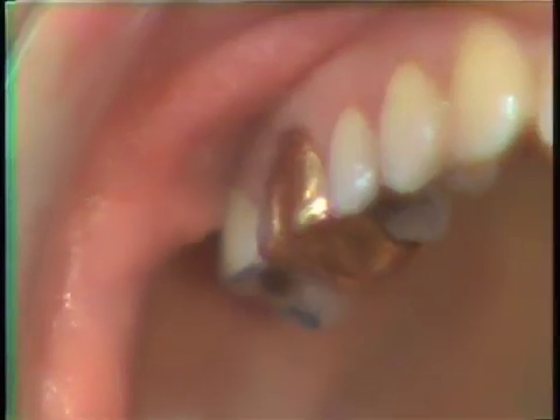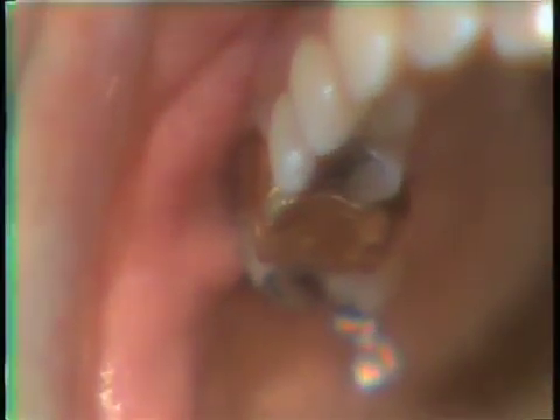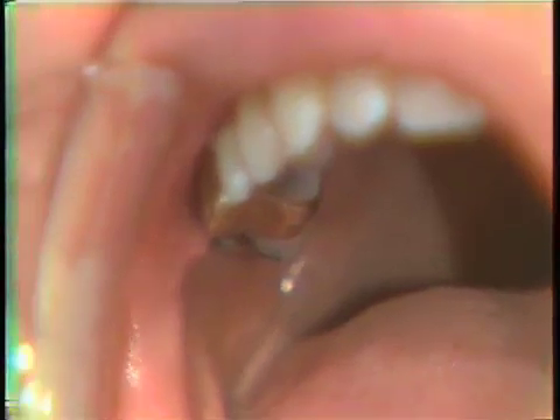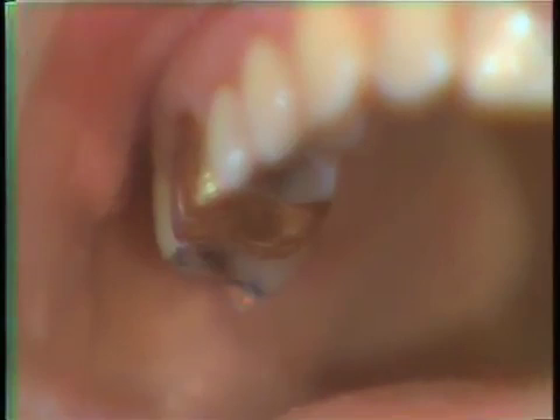You can see the contour of the crown harmonizing with the contour of the buccal surfaces of the adjacent teeth. Sometimes on a cast restoration, the mesial buccal aspect of a bicuspid or molar may be considered an aesthetic problem due to the metal showing on a wide smile.